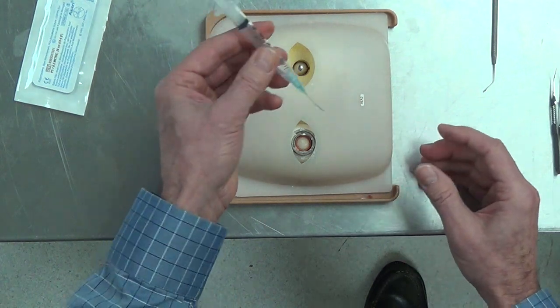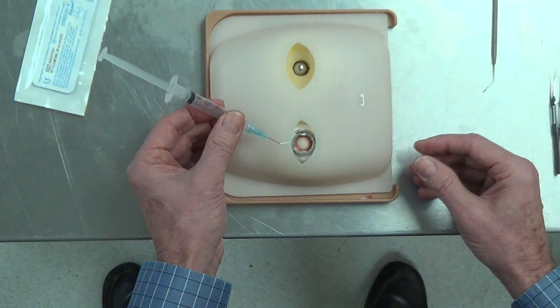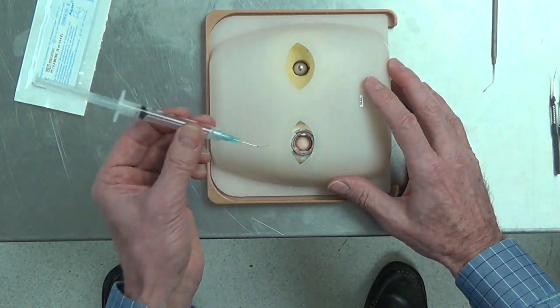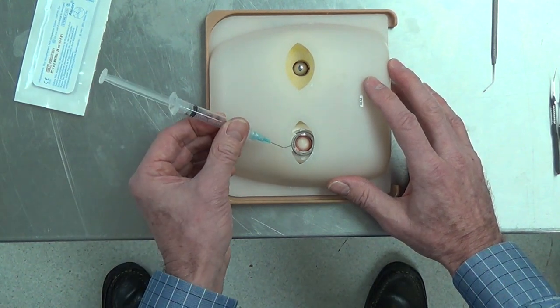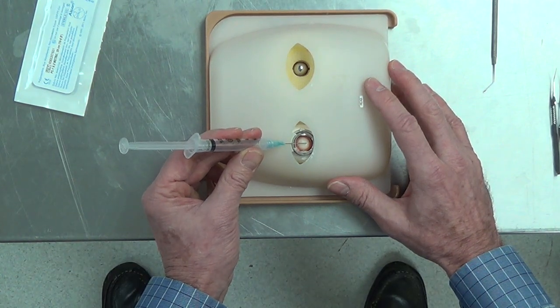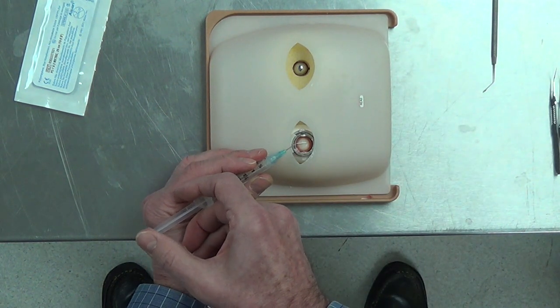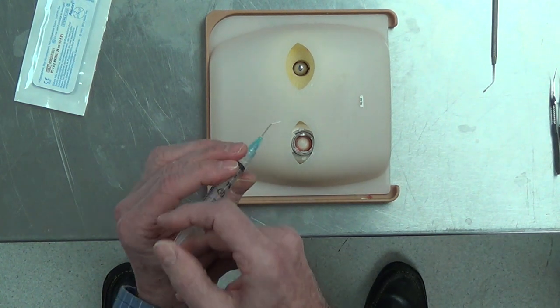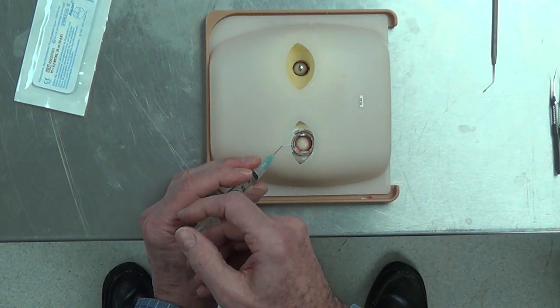For viscoelastic, the principles are the same — entering the eye in the plane of the wound. I'm going to use my left hand, pronating here, coming in and going into the opposite end of the anterior chamber. Sometimes I can angle it a little bit, go all the way to the end, inject my viscoelastic, and slowly come out in this position. I'm not lifting up, I'm not moving the eye — coming out in the plane of the wound.